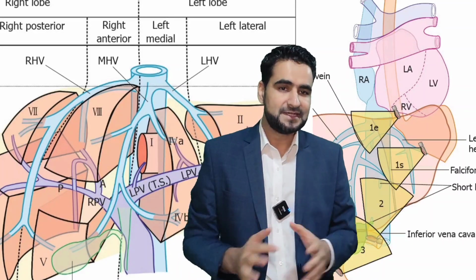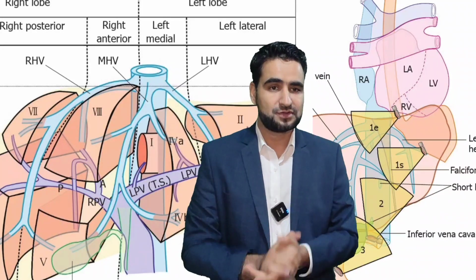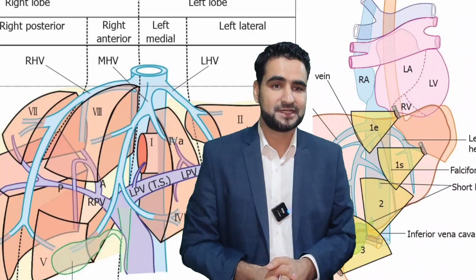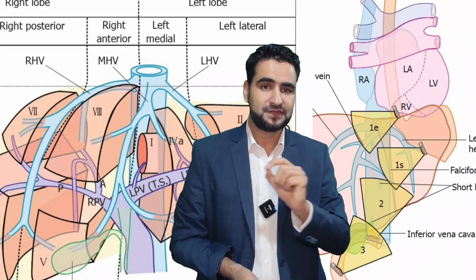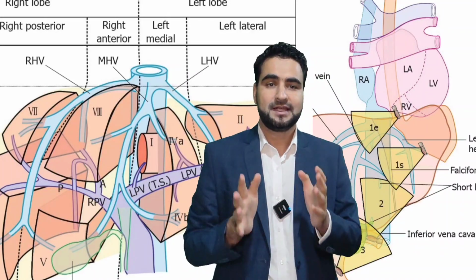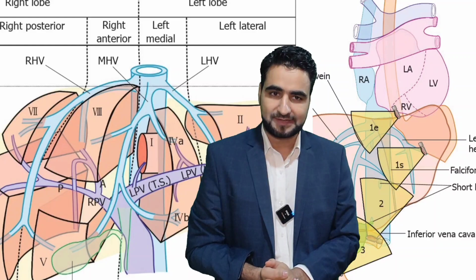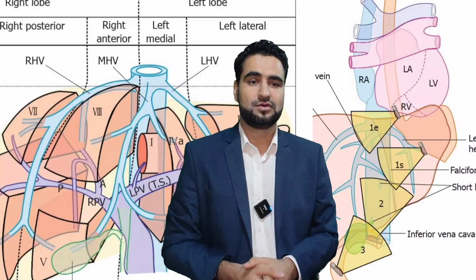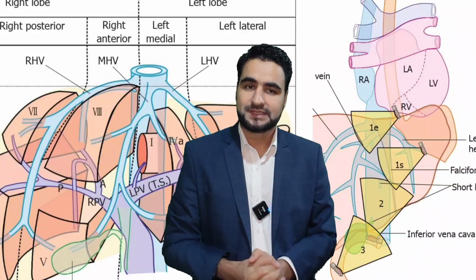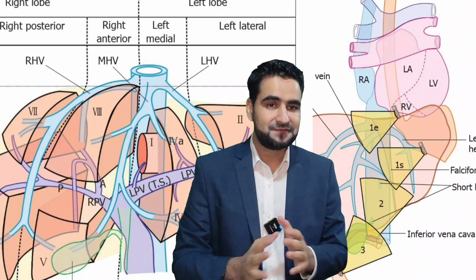Imaging from the descending part of the duodenum gives a unique vantage point of the retrohepatic inferior vena cava, right lobe segments, and the caudate lobe, which are often difficult to visualize from standard gastric stations. It is particularly valuable when evaluating posterior liver segments, hepatic venous outflow, or lesions near the inferior vena cava. Let's go step by step through the counterclockwise sweep, analyzing different views.